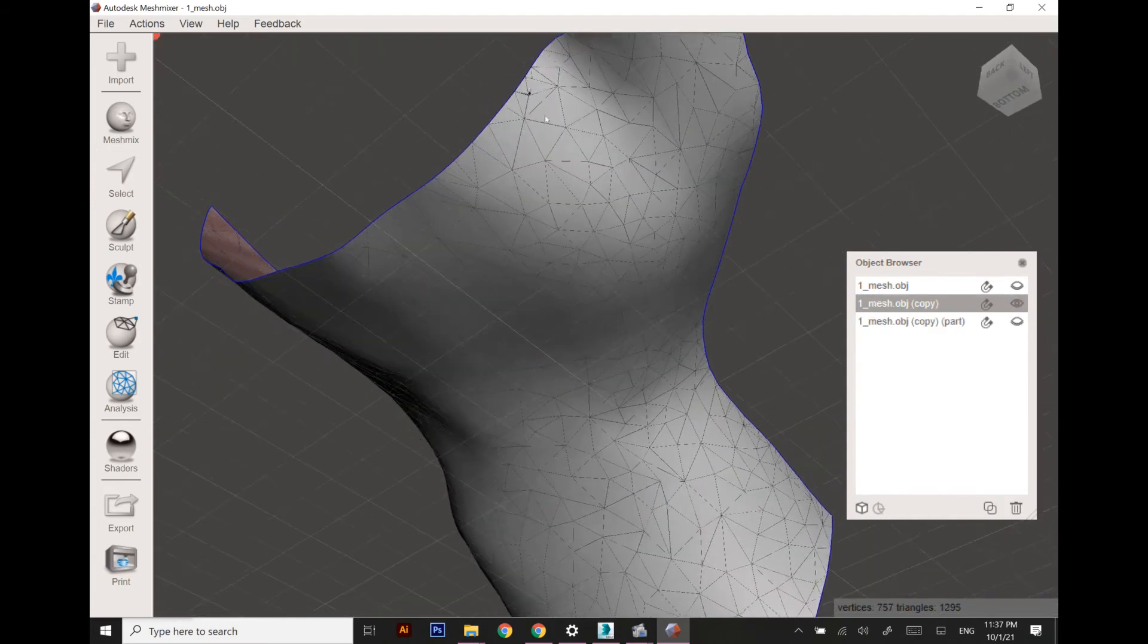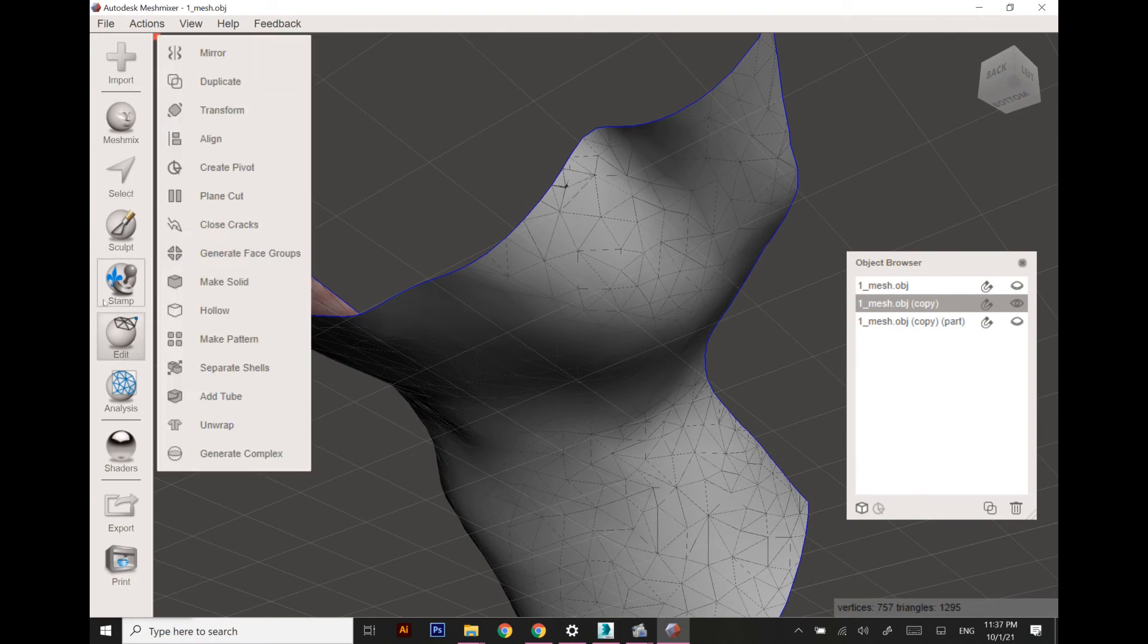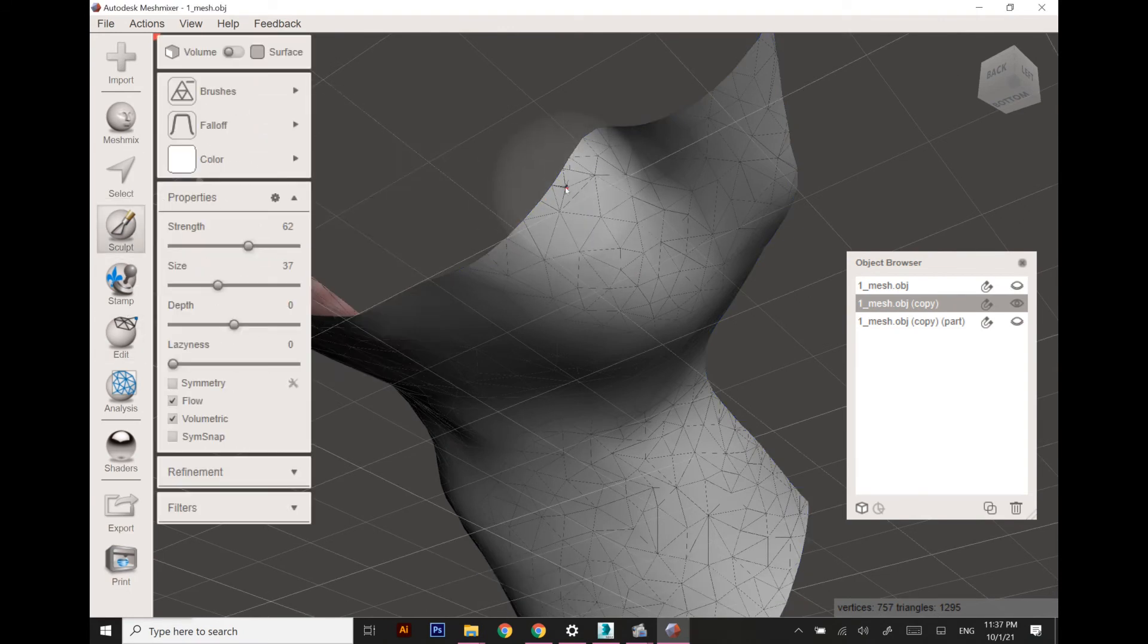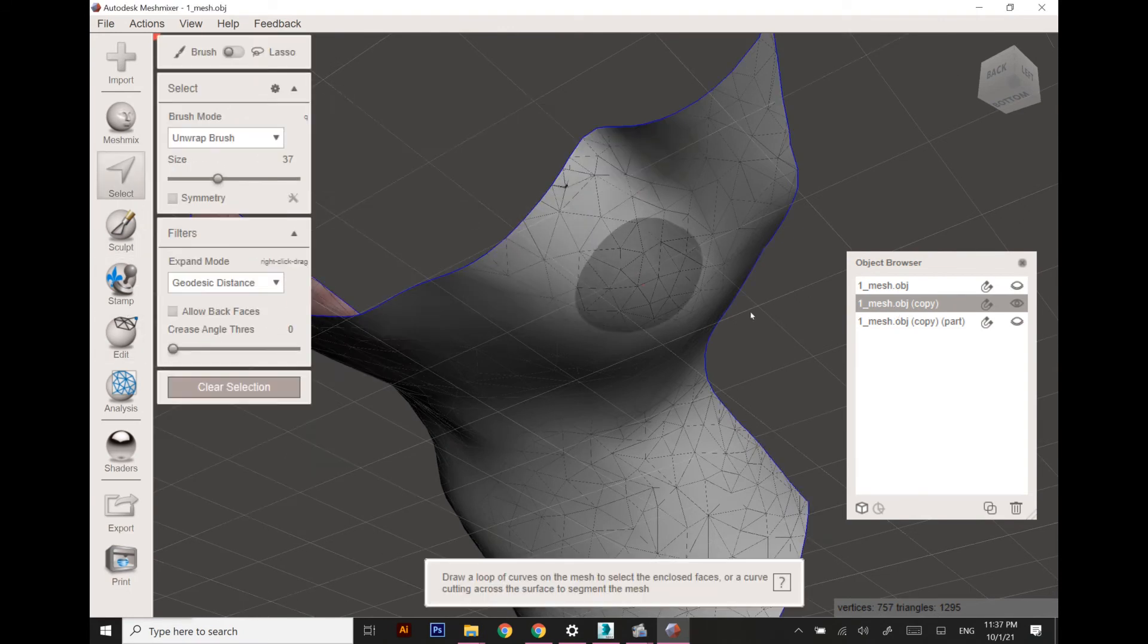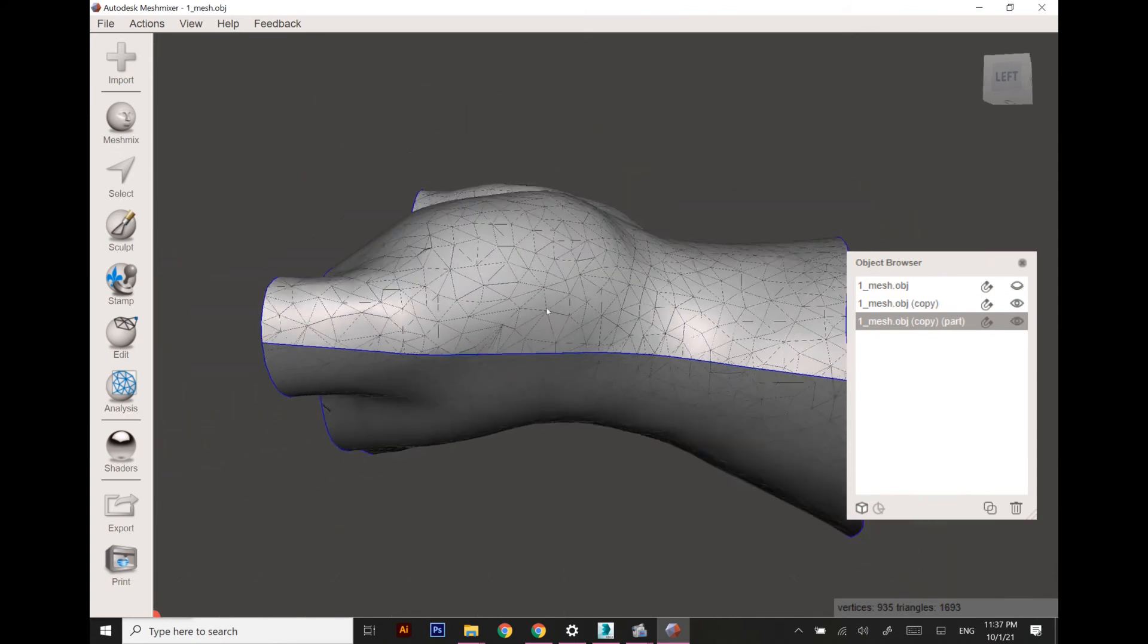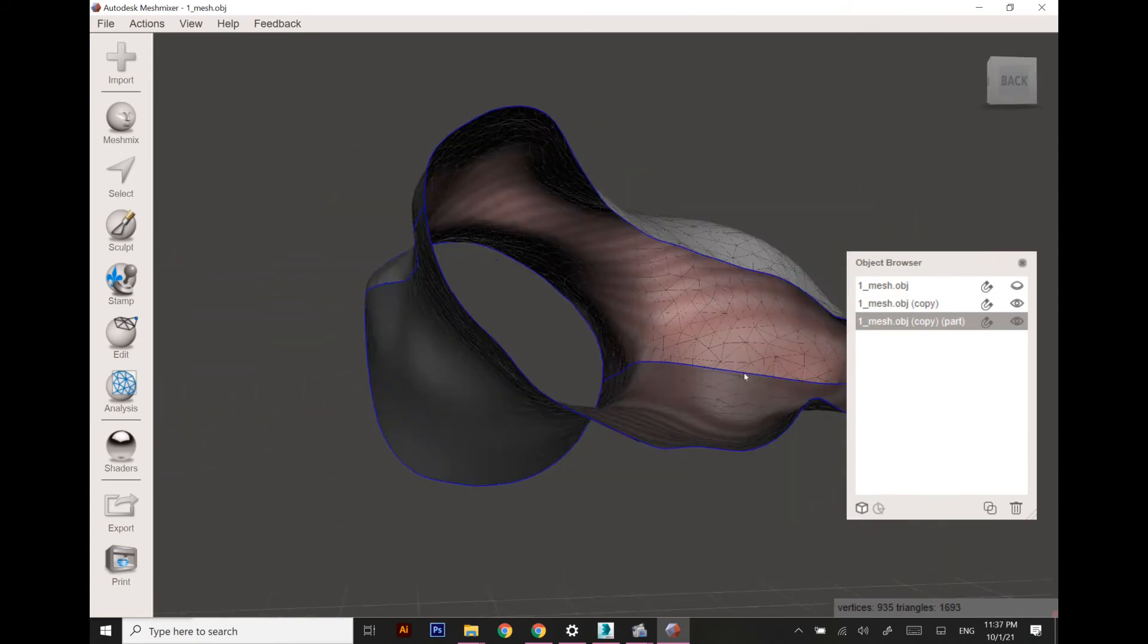As you can see, this is the top surface of the hand and this one is the palm area.